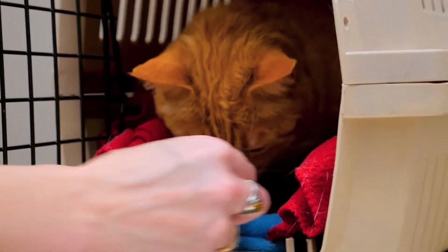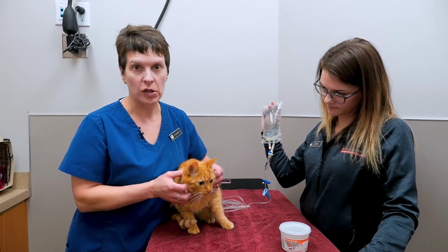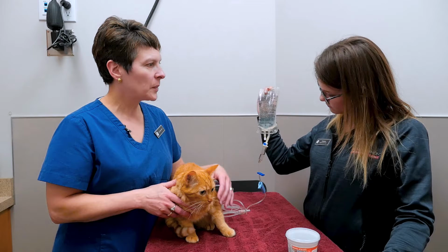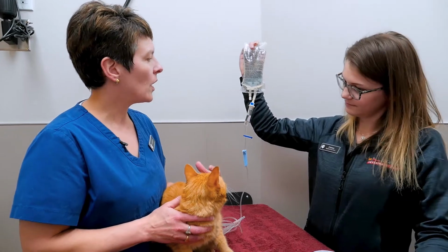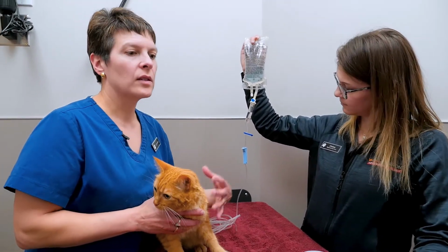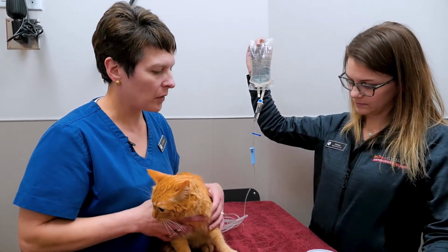So we're here with Hobbs now, and he's going to be our demo kitty so we can show you how to actually do the injection part of giving fluids. Chelsea's going to help us with a little bit of gravity. Ideally, we want to hold the bag up as high as reasonably we can to make the process go a little bit faster. The lower you hold the bag, the slower the fluids will go. The higher you hold the bag, the faster the fluids will flow.